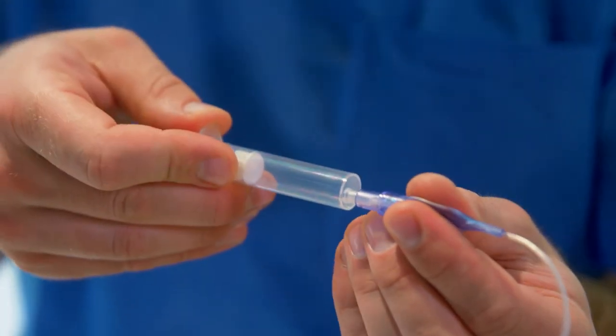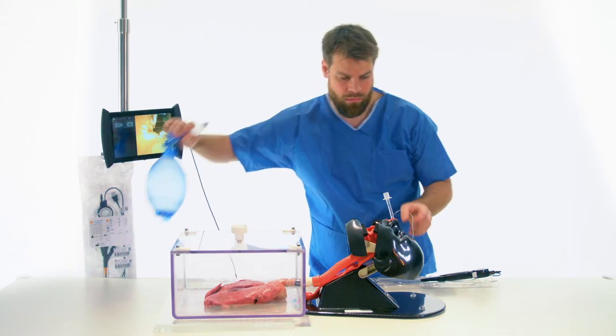The cuff is inflated and the procedure is finished.